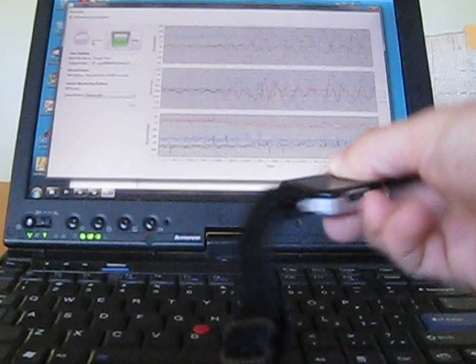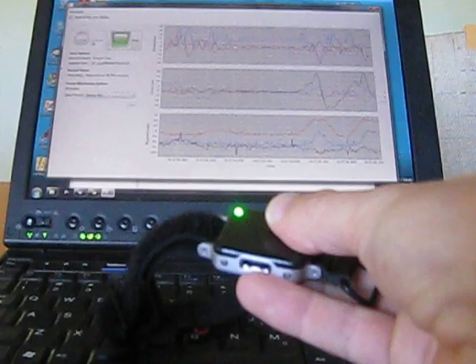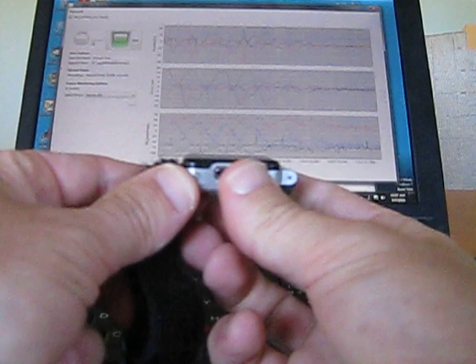Similarly, you can rotate it and excite the different gyros if you rotate it in the different modes. You can see the effects of the magnetometer here are also tracking essentially the orientation, or how the device is located relative to Earth's magnetic field.